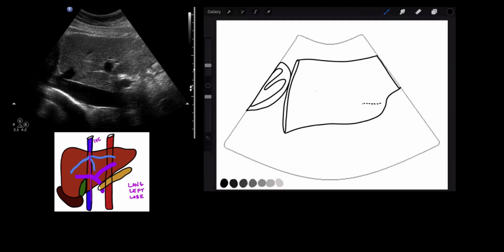In this picture here, we do see a little bit of the ligamentum venosum. Ideally, we will be beyond the caudate lobe, sitting well past where we can see the ligamentum venosum, but sometimes it is not always possible.